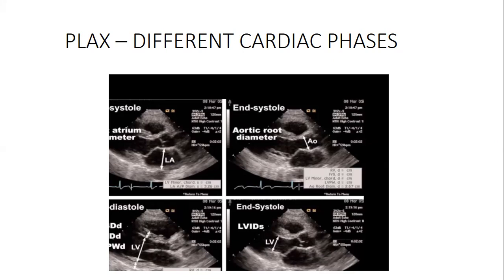Okay, according to what I read, it's the number of pulses sent per second. It is inversely proportional to the pulse repetition period, which, to my own understanding, is the sound that the probe transmits to the reflector.